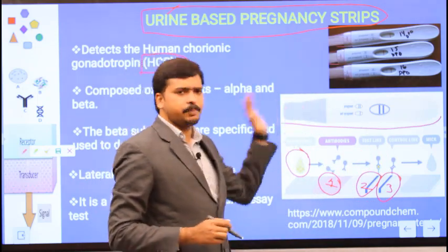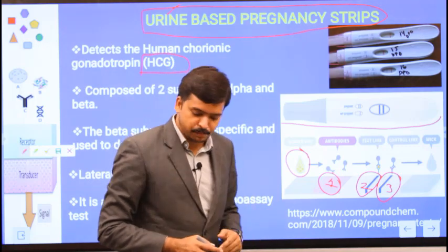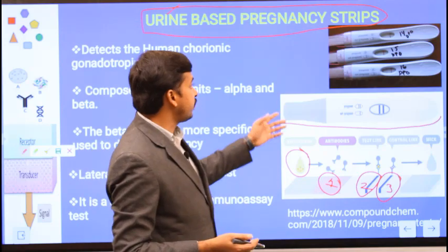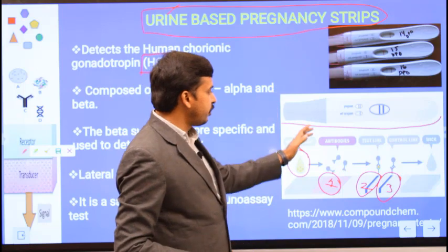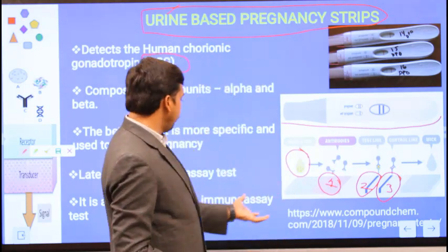See, there is a strip available. Whether it is working or not is also very much important for us to identify. It's more than important to find whether she is pregnant or not, right? So to confirm this, you have a control line also. So now let us go into the principle.